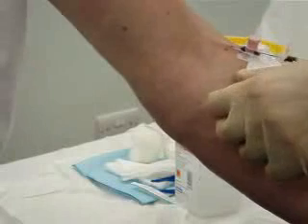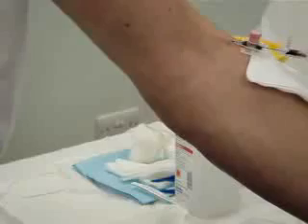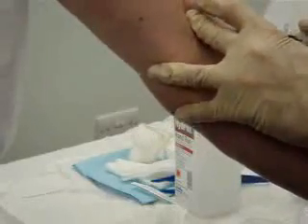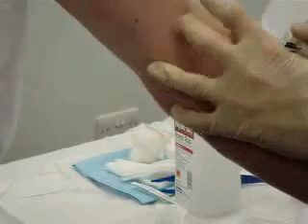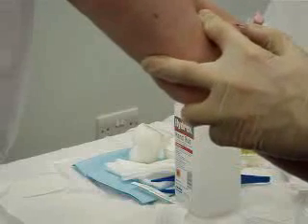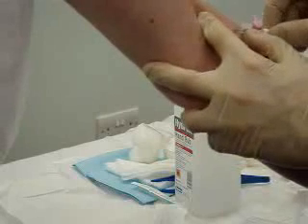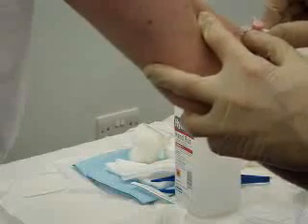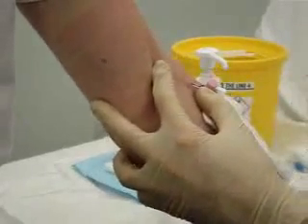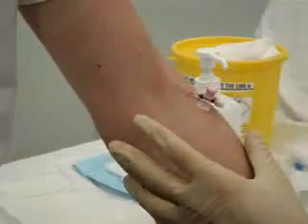But the next trick is to actually pop the cannula top back on the end of the cannula after you've taken the sharp out. So I'm going to do this quite quickly. I'm going to put a bit of pressure over the vein to stop the flashback, take the cannula needle out, and then put the cap back on nicely. Now if you want to take blood from the venflon, instead of putting the cap on there, you can simply put a syringe on to take the blood. So as you can see, the cannula is in position quite nicely.